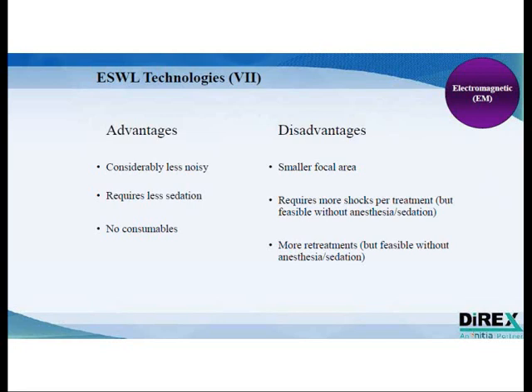So if electrohydraulic technology can treat, let's say, 80% of the patients, has a full fragmentation rate of 80%, let's say, then the electromagnetic technology can vary anywhere from 50 to 70% of full fragmentation.